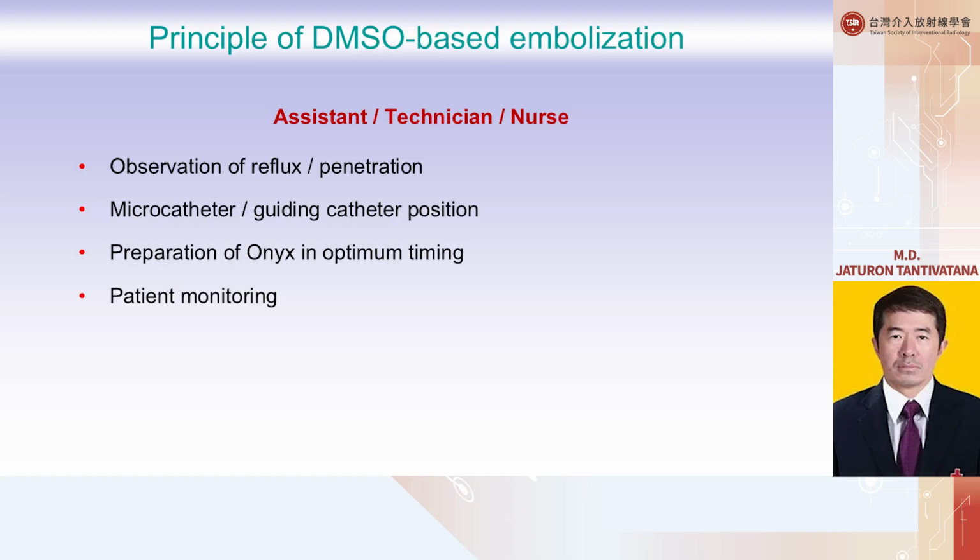Anyway, if we are using the plug and injection technique, because in some cases we cannot use the balloon, or in complex cases, for example, the assistant is quite important because they have to remind you of excessive reflux or migration of the Onyx. That is maybe one of the disadvantages of using just distal catheterization and not balloons, which I think Dr. Liu may explain to you better.